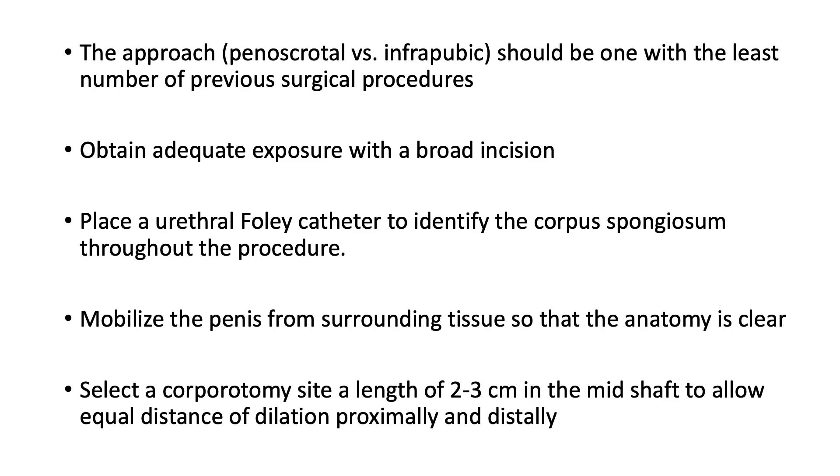I always place a Foley catheter before proceeding in this type of case. The reason is to identify the corpus spongiosum throughout the procedure. The goal is careful dilation to avoid perforating the corpus spongiosum, because the whole procedure would likely have to be abandoned if the corpus spongiosum is violated.